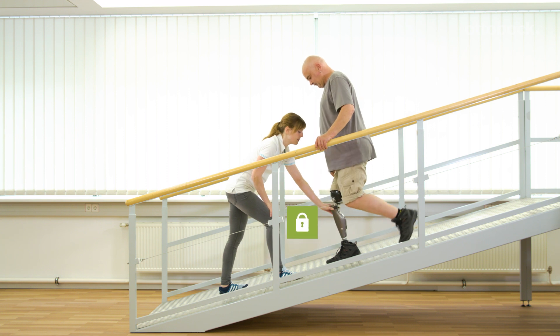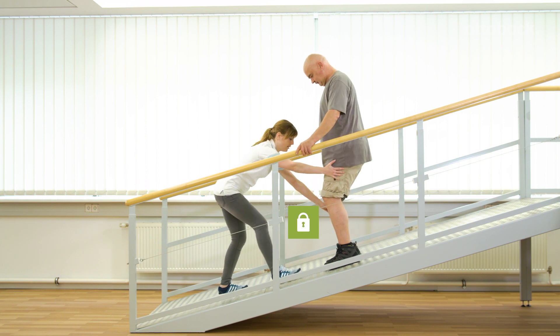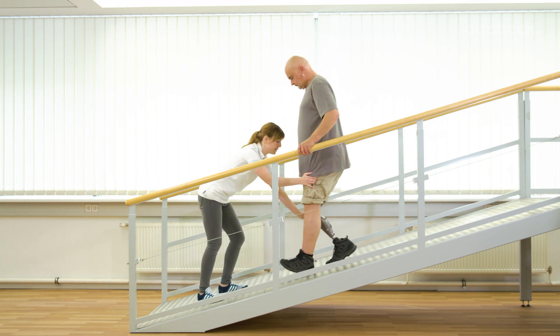Gerhard shows how he starts walking with the yielding step. As he moves forward, the knee rotates forward and bends against the stance flexion resistance.